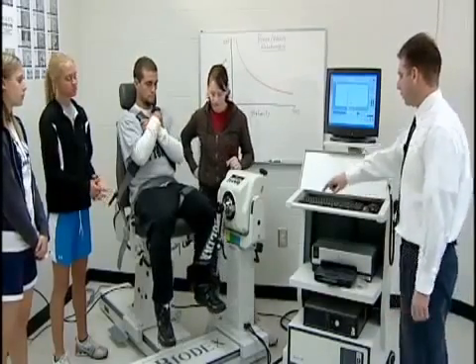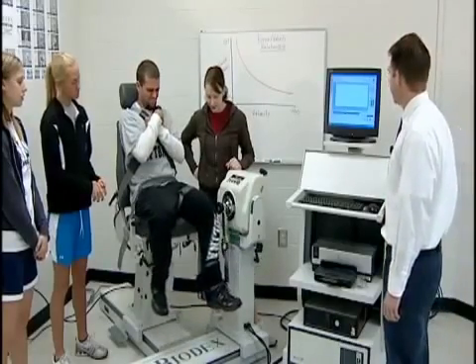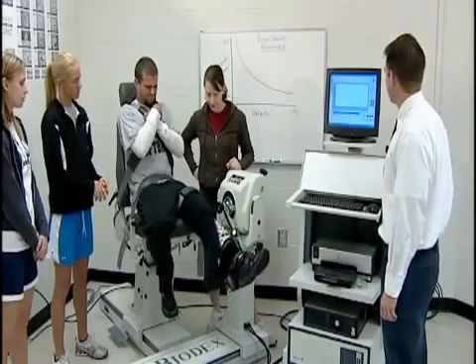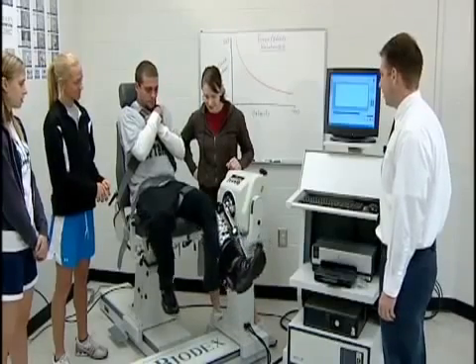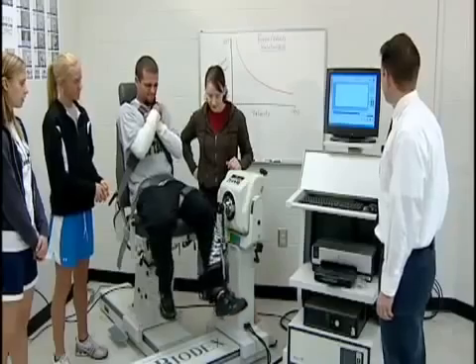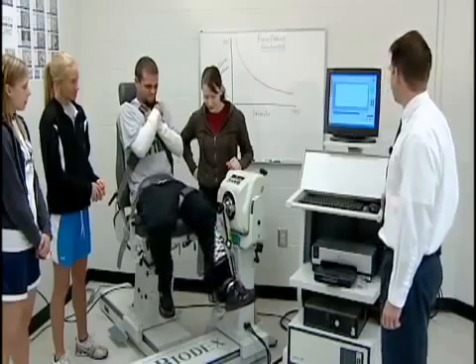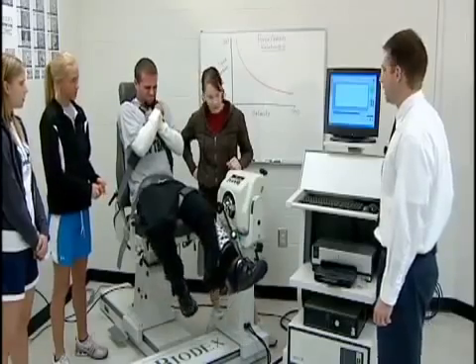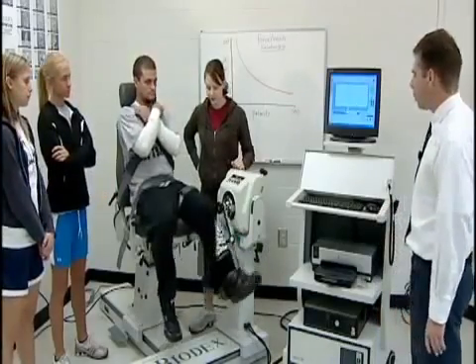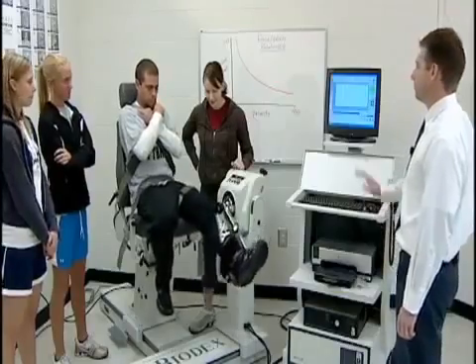Zach performs the slow 30 degrees per second test, moving through the full range of motion while being reminded to keep breathing and not hold his breath. After completing those repetitions, a final fast set is performed to conclude the testing session, demonstrating the full range of the force-velocity relationship across all three speeds.